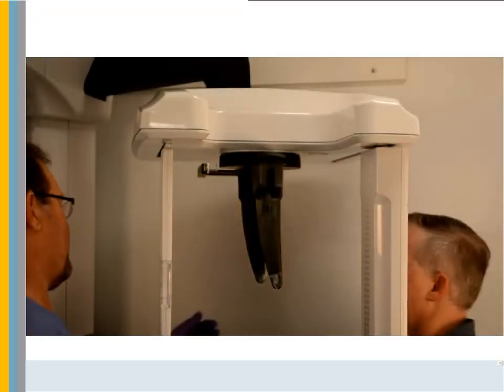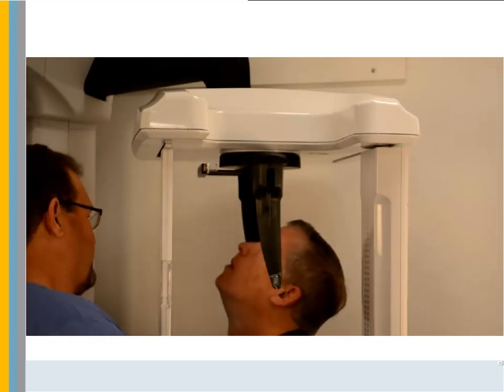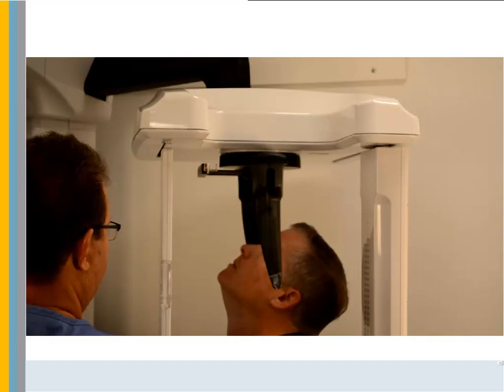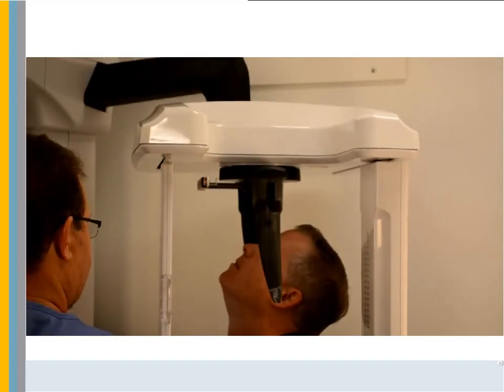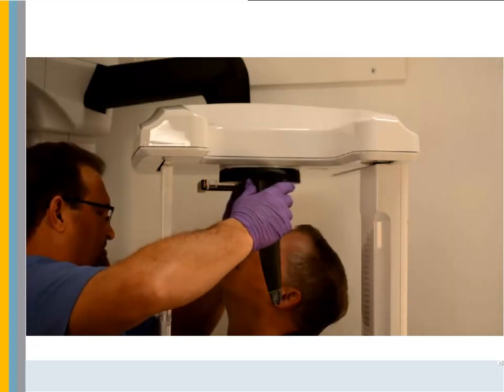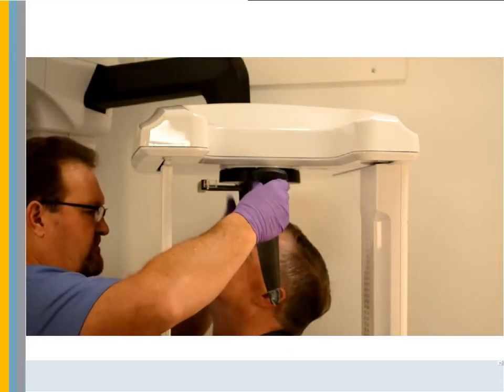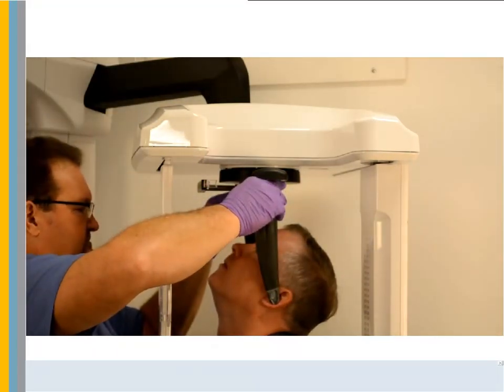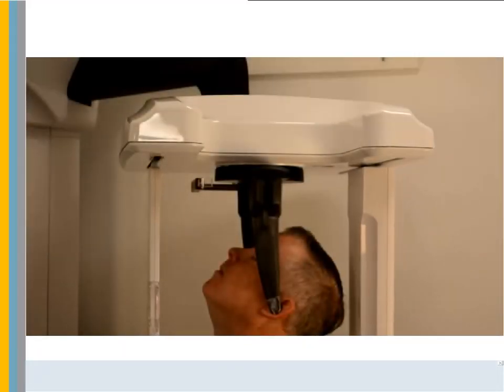Make sure the head clamp bar is fully open and covered with an ear cone sheath. Do not pull from the bottom of the head clamp. After the unit is at the correct height, ask the patient to enter the unit and slowly close the head clamps. Align the patient's head. Take the scan.